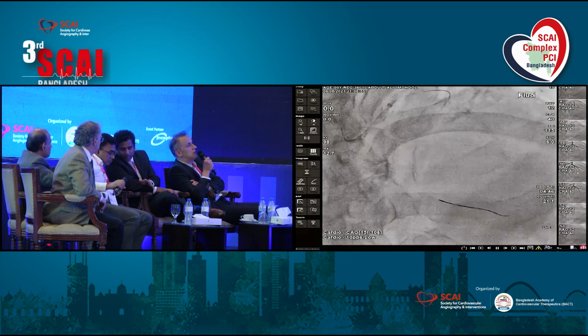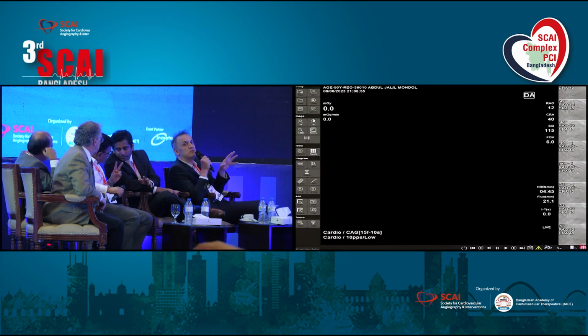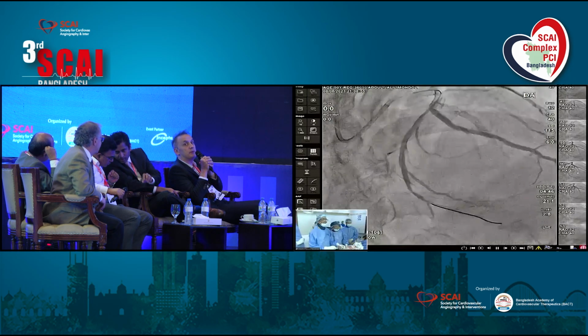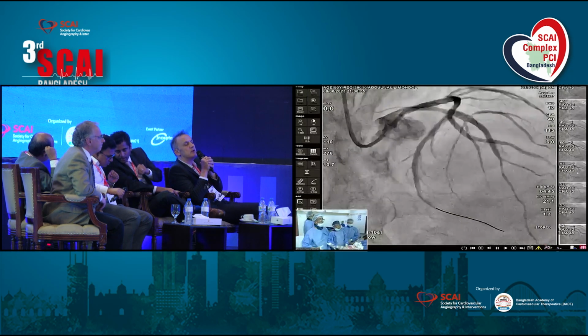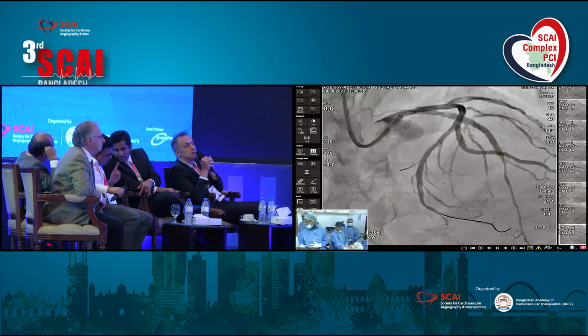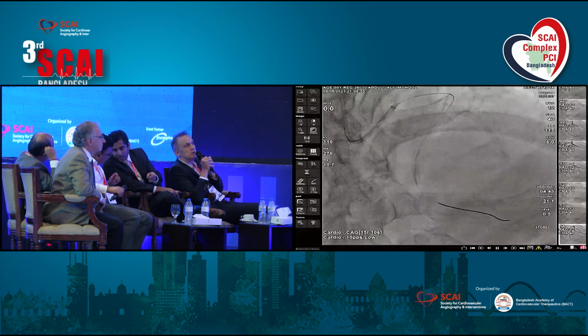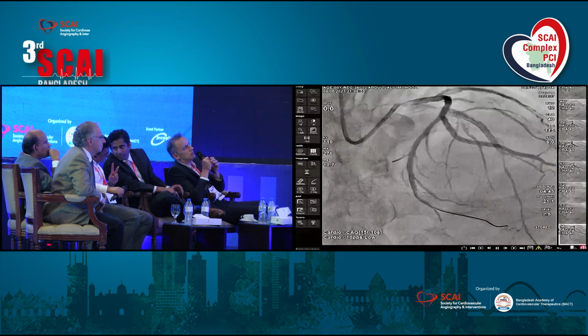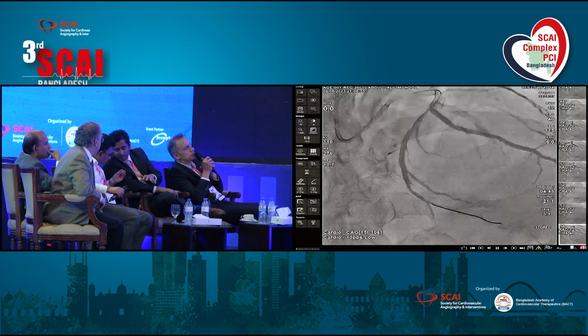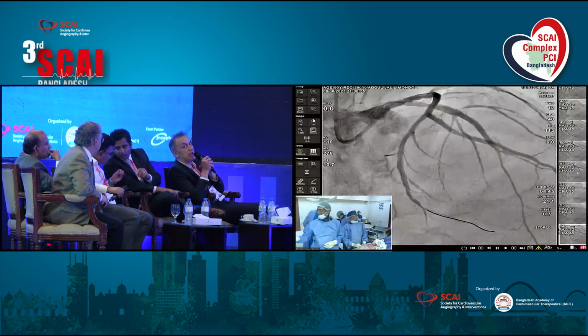Yes, I think predilatation wasn't that good, as Louis mentioned. We have to be careful about that, because if you have circular calcification, we cannot expand the stent. We need the 3.0 NC balloon, so this is very important. Predilatation is very important. Of course they do their best, but I don't know if they can expand it or not.